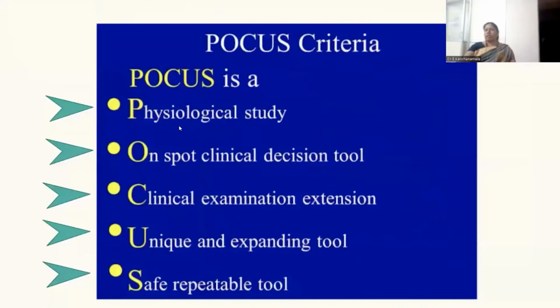So as such, POCUS is used as an on-spot clinical decision tool, but it is an extension of the clinical examination, and it is a safe and repeatable tool with an expanding horizon.